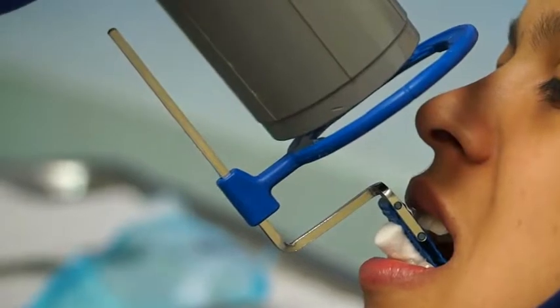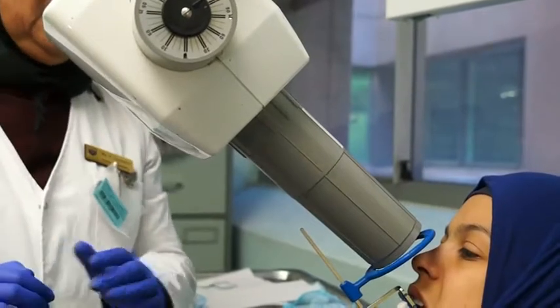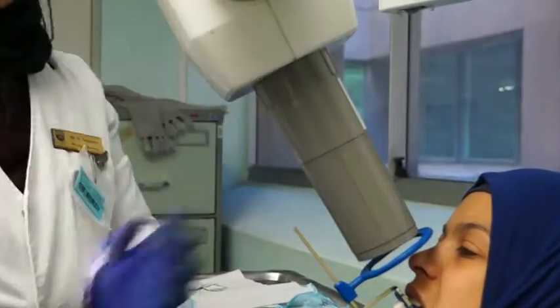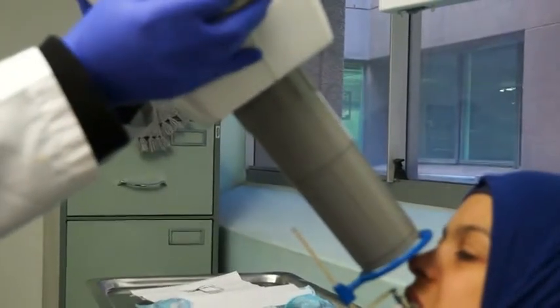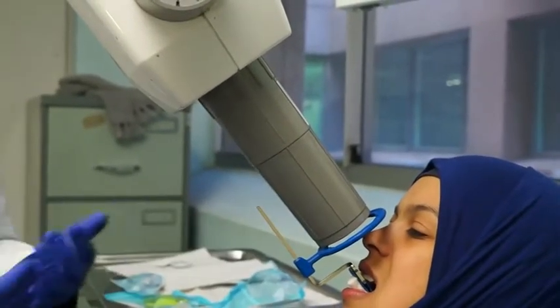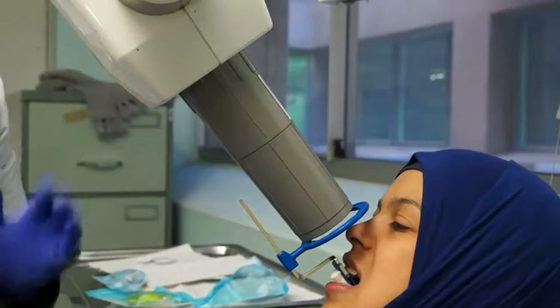If the tube is angled incorrectly and the ray is not perpendicular to the film, look at the cone relative to the indicator — your image is going to be elongated. Or if you use excessive vertical angulation, your image is going to be foreshortened. The basic principle says the central ray should be perpendicular to the film, and the film should be parallel to the long axis of the tooth. Because we position the film further into the palate, we have a larger object-film distance, so we must increase the source-to-film distance.